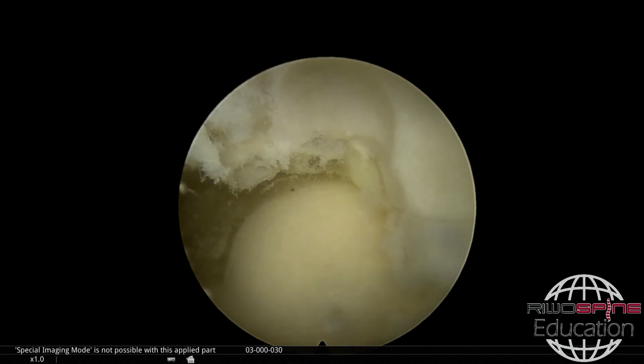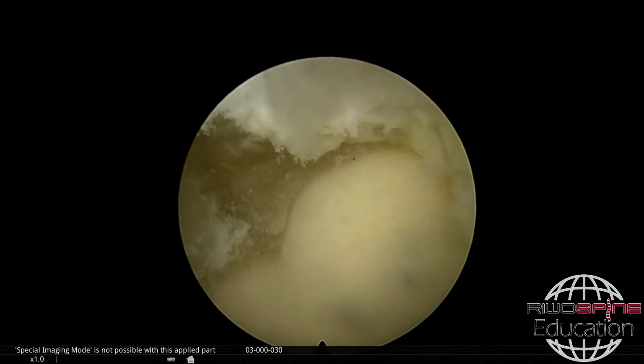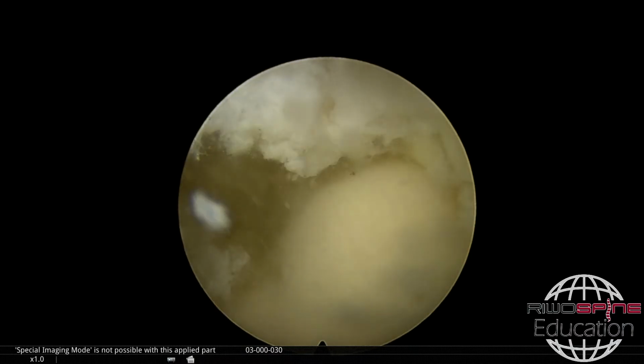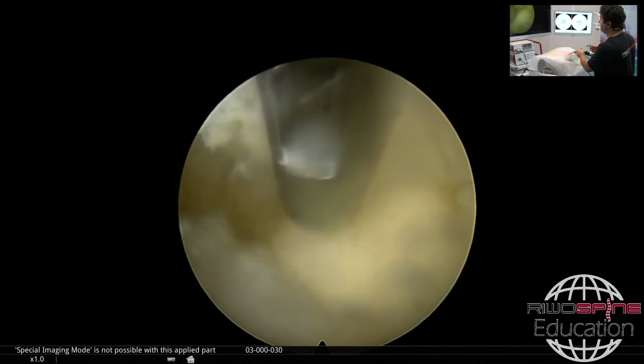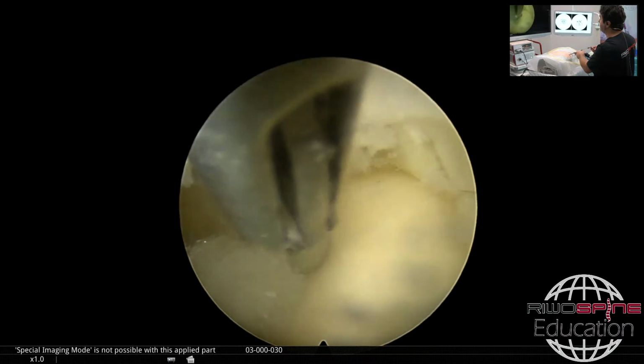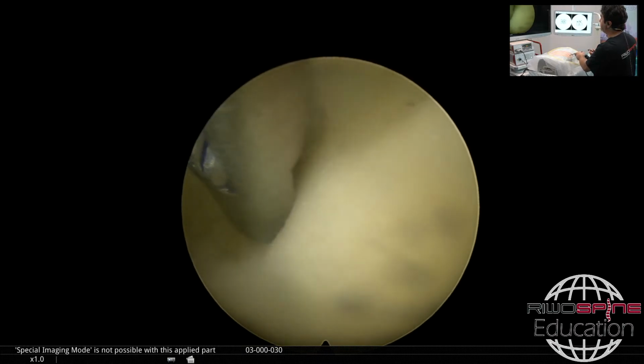As you see in this model, directly we see the herniation in the foramen, a little bit in the paramedian area. Here, what you see is the epidural fat tissue, which I cleaned, and also the part of the ligamentum flavum, which is located medial to the facet joint at this level.